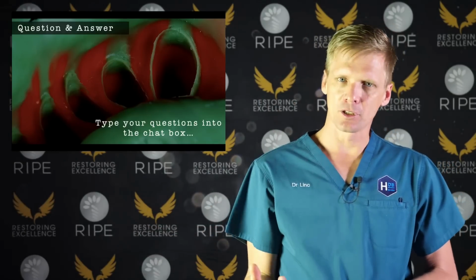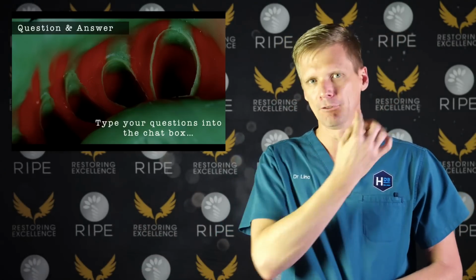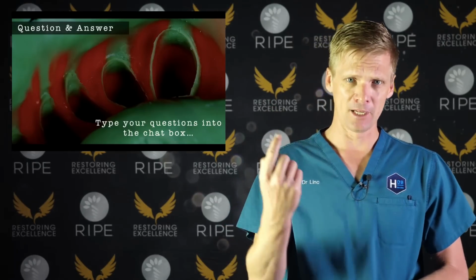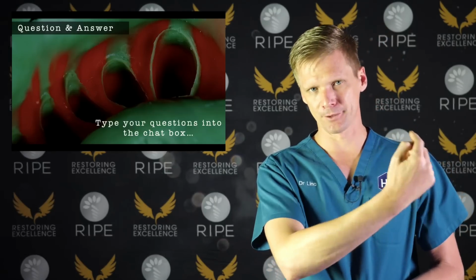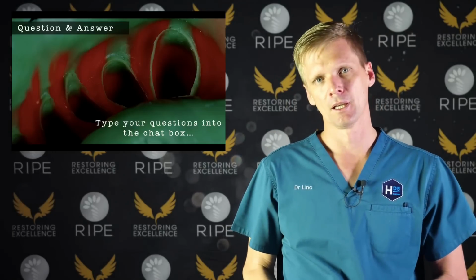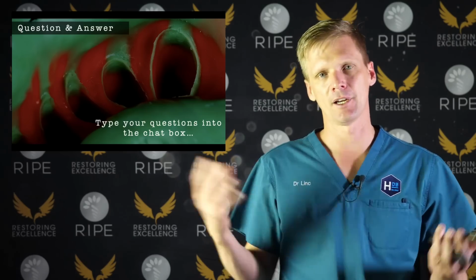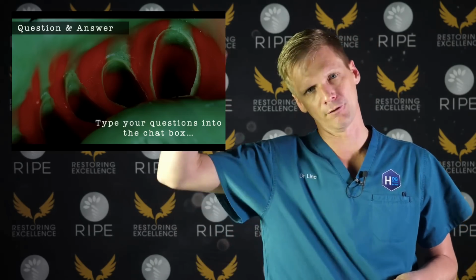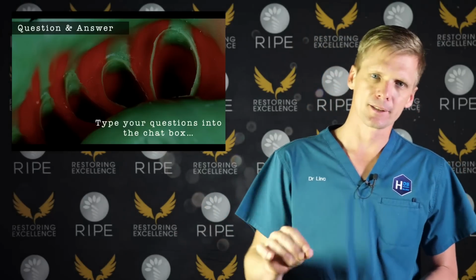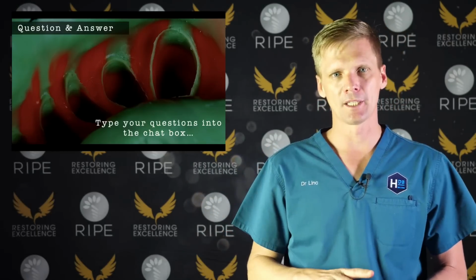And what happens when you take the impression for those cases is that the impression tears interproximally and it tears over the margin. So if you have black triangles on a veneer case that you aren't going to open the contacts, then you need to get flowable and block them out from the palatal side or the lingual side. Not over the margin, but just enough so the silicone doesn't flow between the teeth. I've taken veneer impressions like 9 times, and they just keep tearing and tearing until it finally dawned on me I'd never get them because the silicone flows down through the black triangle out the other side and then it's going to tear every time you take the impression out. So those cases you need to block out from the palatal or the lingual with some flowable and then cure it.